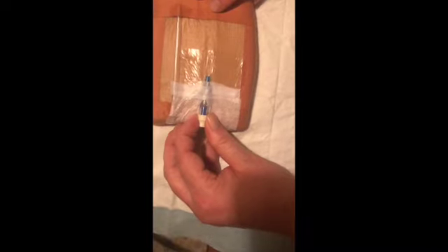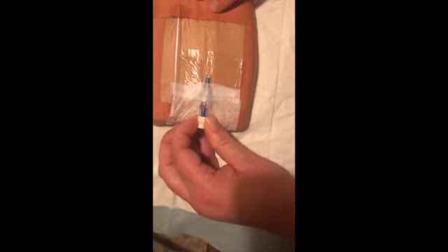Then with the final steri-strip, I've seen some people place it underneath the bung to fully secure the dressing underneath. But what I like to do is again put it over the top where the bung and the cannula point connect, and again push down and pinch. And I'm giving a good tug on that, and that's just an extra securement point so the cannula can't dislodge.